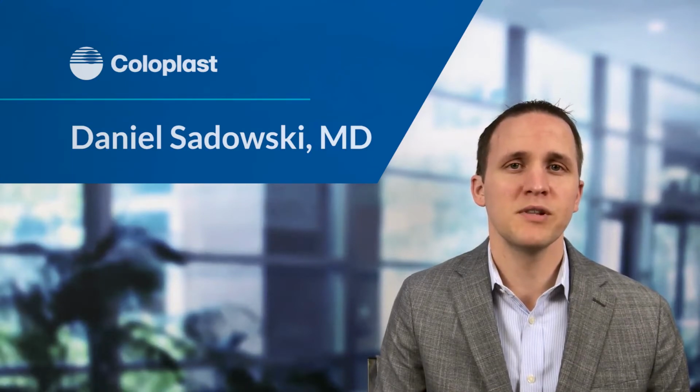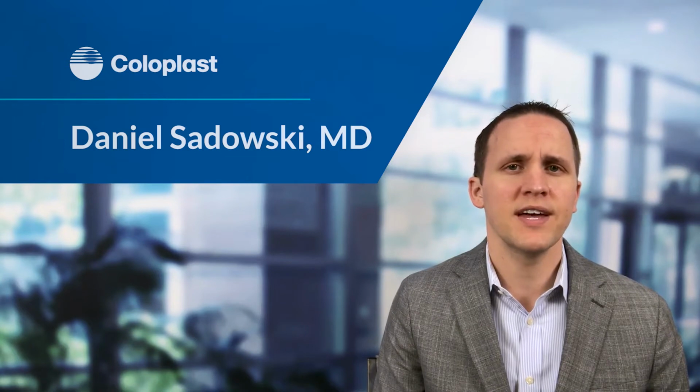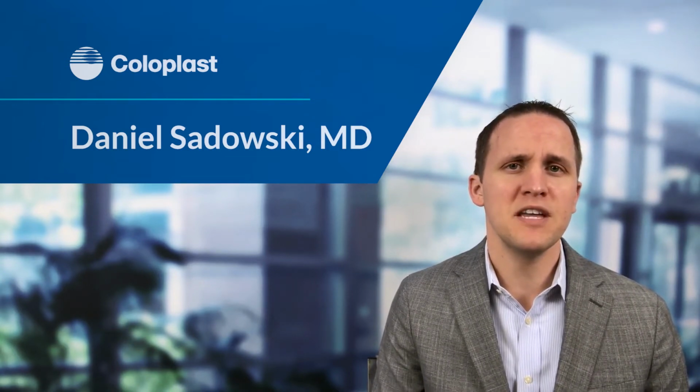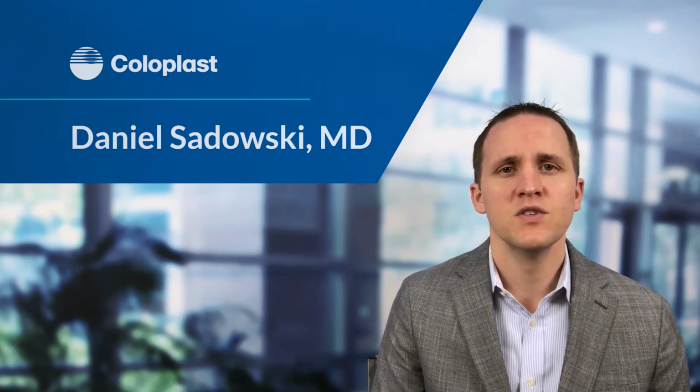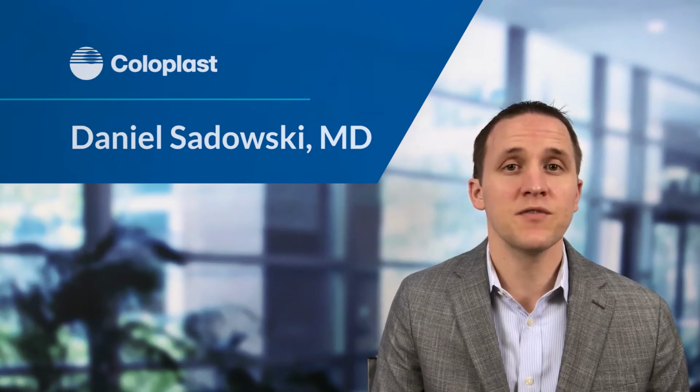The implant is completely concealed where you cannot see it from the outside. The pump is within the scrotum, the cylinders are in the penis, and the reservoir is within the belly or the pelvis. And all of these are under the skin, so you can't see it from the outside.